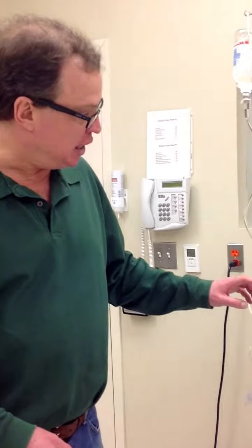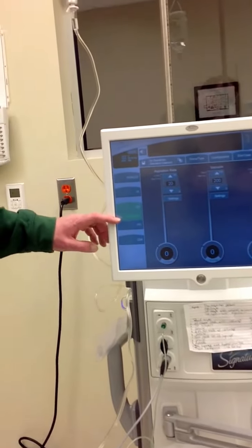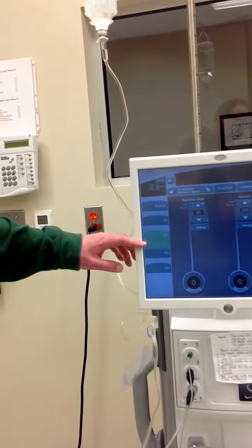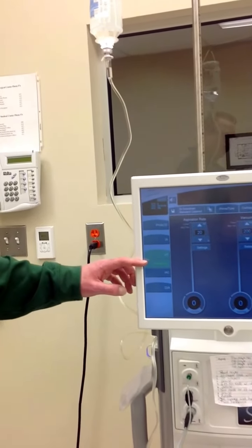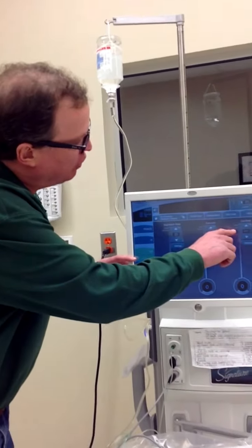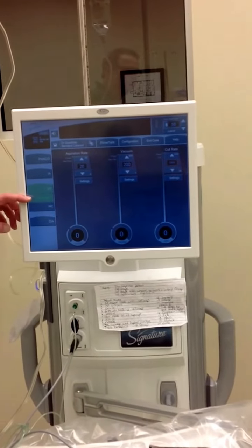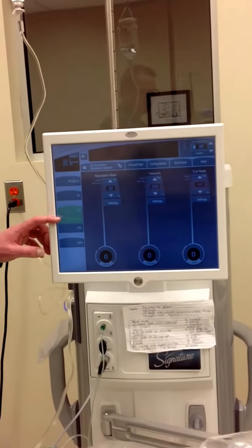Is it just labeled ICA? It's not labeled ICA, this one's vitrectomy 1, excuse me, but that's just, they renamed it. Right. And if you look over here on the panel, I see it, it says ICA. Okay. So here's how this works.